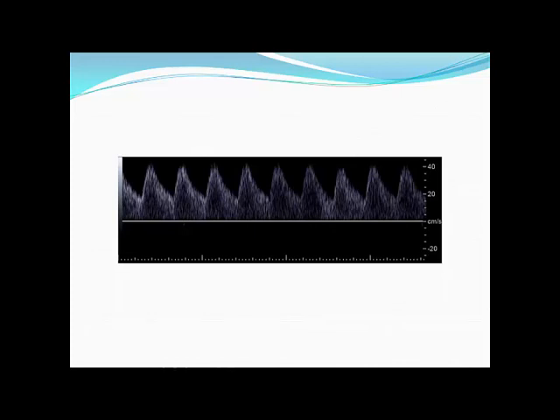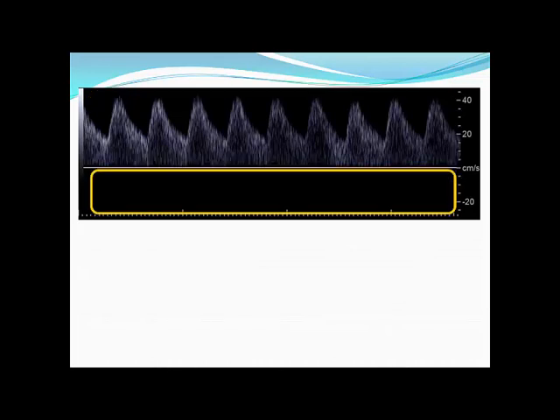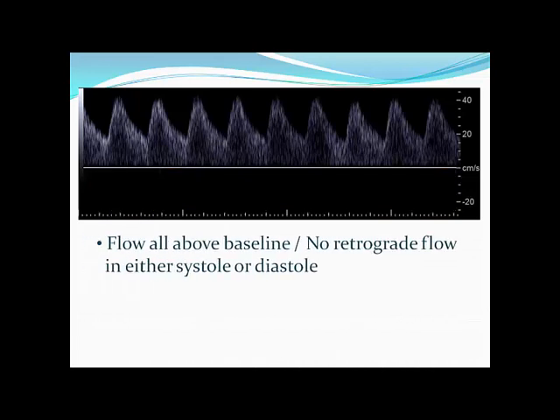This is a representative of a normal pulse wave tracing of an umbilical artery in the cord of a fetus. The blood flow is seen to be all antegrade above the baseline. There is no retrograde or reverse flow seen in a normal umbilical artery.